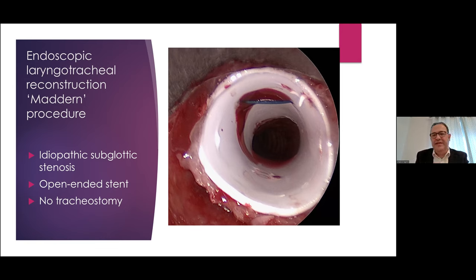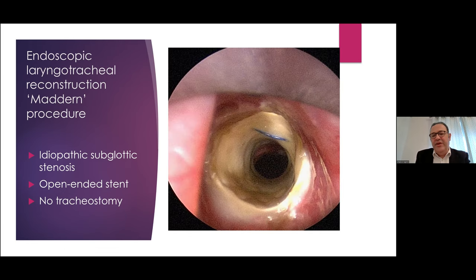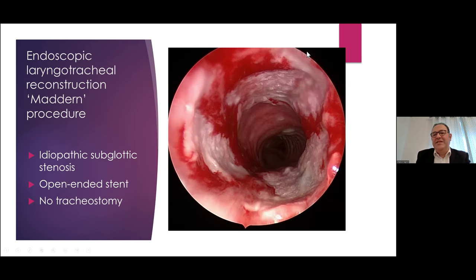So all of that is endoscopic, just with a transcutaneous stent, and we leave this in place for 2 weeks. You come back after 2 weeks, you'll have some biofilm over it, but you remove it, and you can see islands of keratinocyte and skin taken into the areas that you exposed previously. The idea here is that there is interaction between the keratinocyte and the fibroblast, leading to suppression of fibrosis.